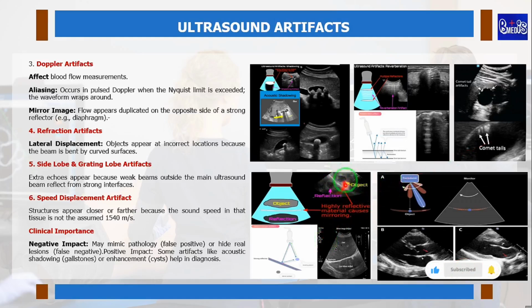As you can see on this assessment of the liver, this is a liver lesion here, but you can also see it here. This is the normal image, this is the reflected image. You can also see this mass here. So an inexperienced person may conclude this is a double mass, whereas this is just a normal lesion but reflection. So the next one we see is still an image showing reflection.